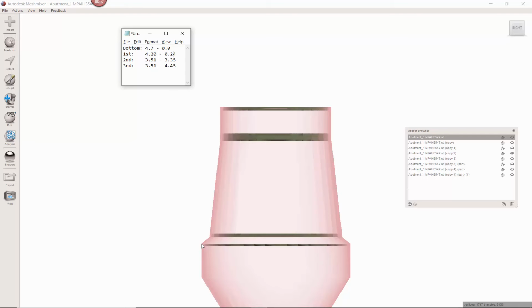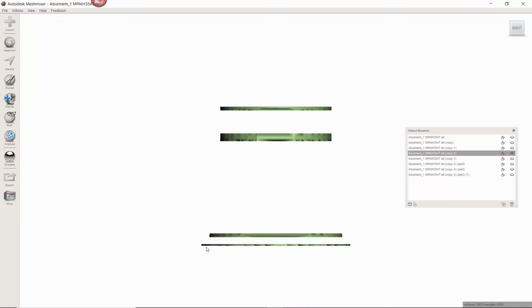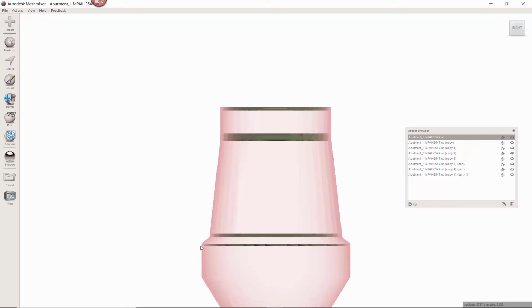And then lastly, from this point all the way to the top, it is 4.45 millimeters. And once again, the diameter is 3.51.